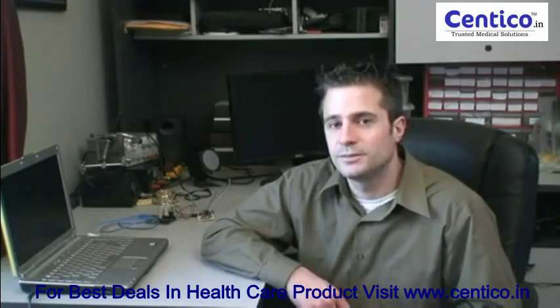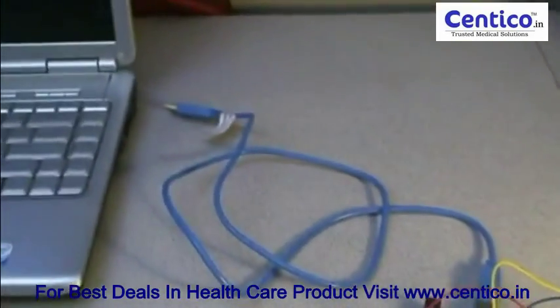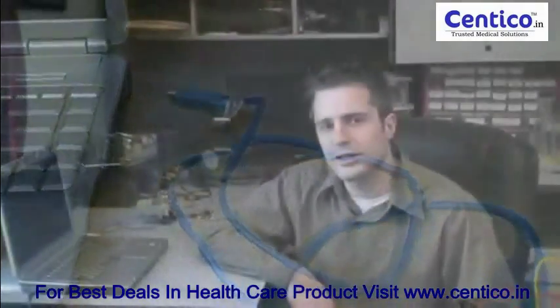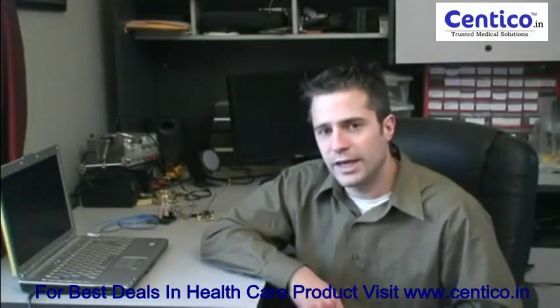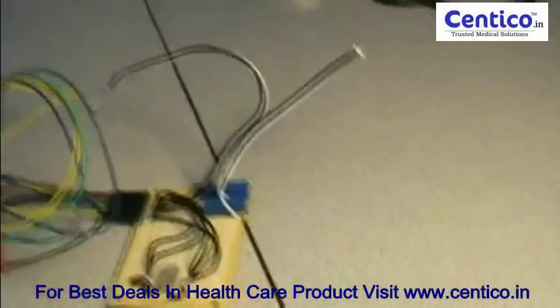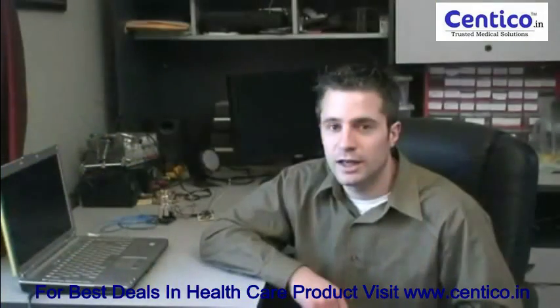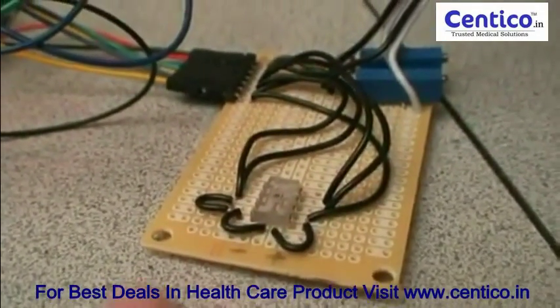We have an Arduino connected to a computer through a USB port, and on the other side we've got a custom-made board with a light sensor. In addition to the light sensor, we also have two LEDs — both a red LED and an infrared LED.